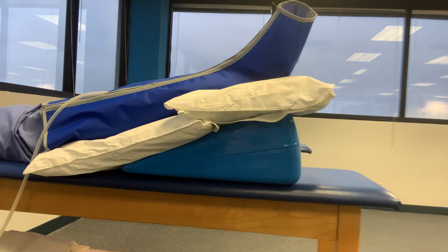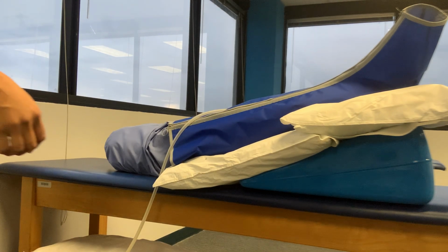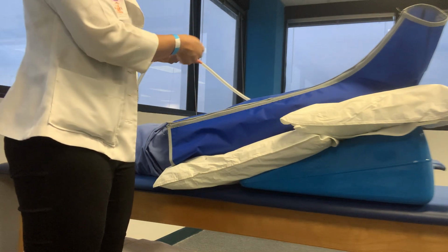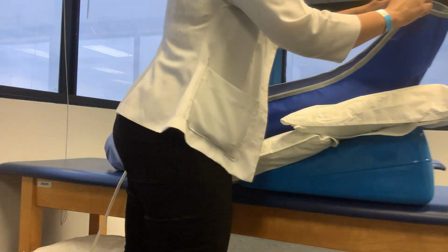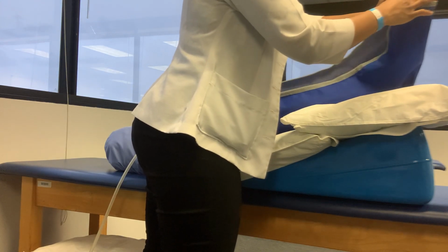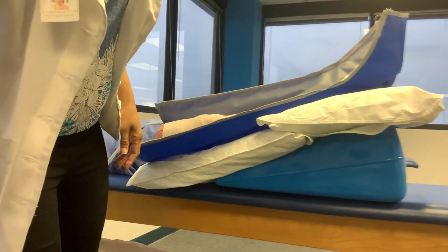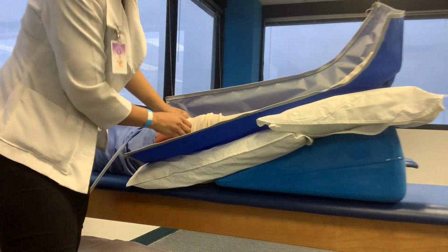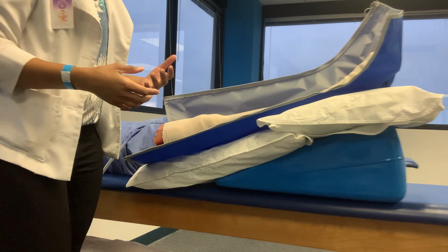So one other thing I have to check before I can start. So I'm going to turn my machine off. And then this is where I'm going to go ahead and check with my patient. I'm going to do my second skin inspection. So I may or may not need to detach the hose, so I'm able to open the sleeve. So I'm going to open the sleeve. And then I'm going to do a brief proximal and distal skin inspection. So I'm just going to pull the stockinette back, and I'm just going to look briefly. I'm just looking to see, do I see any redness or anything after that first inflation, if it was too hard.